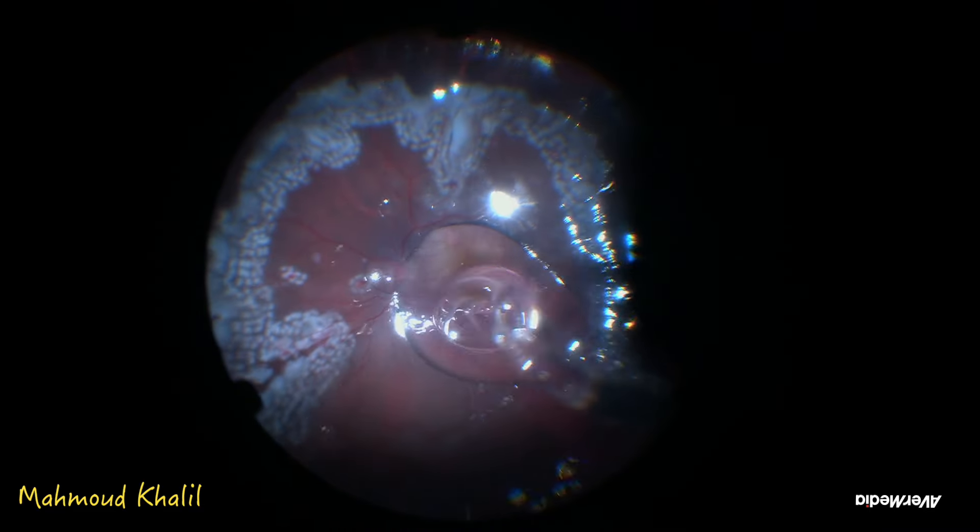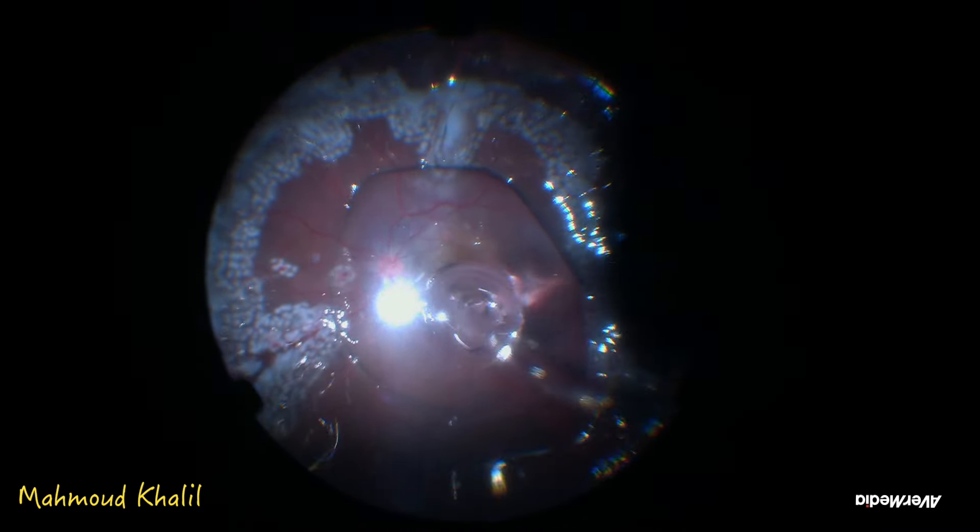And now it is the moment to laser the retina under the fluorocarbon, lasering the edge of the retina and reaching the posterior end of this 180-degree retinotomy. And after doing fluid-air exchange, it is the moment to inject silicone oil. Thank you.